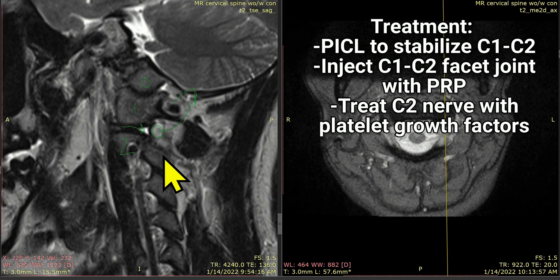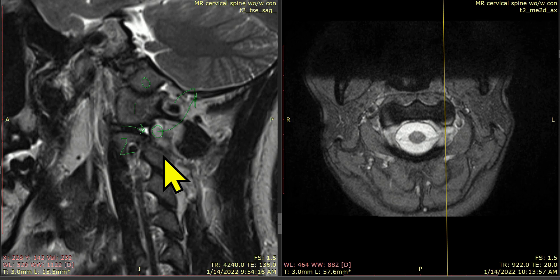Another component of that is going to be treating directly that C1-C2 joint, and possibly that C2 dorsal root ganglion. Interesting case — we don't normally see this much swelling in the C1-C2 joint, and we certainly don't see it pushing against the C2 dorsal root ganglion, but it explains all of her symptoms nicely.